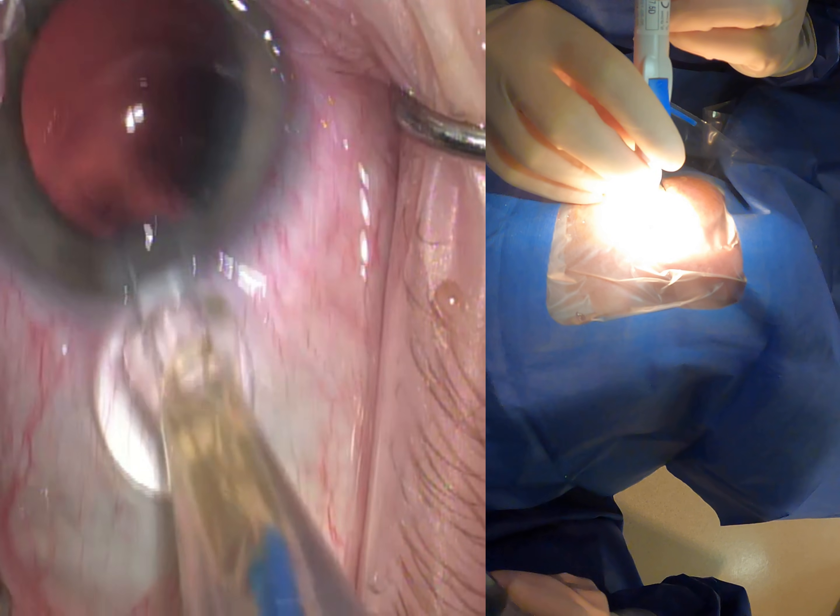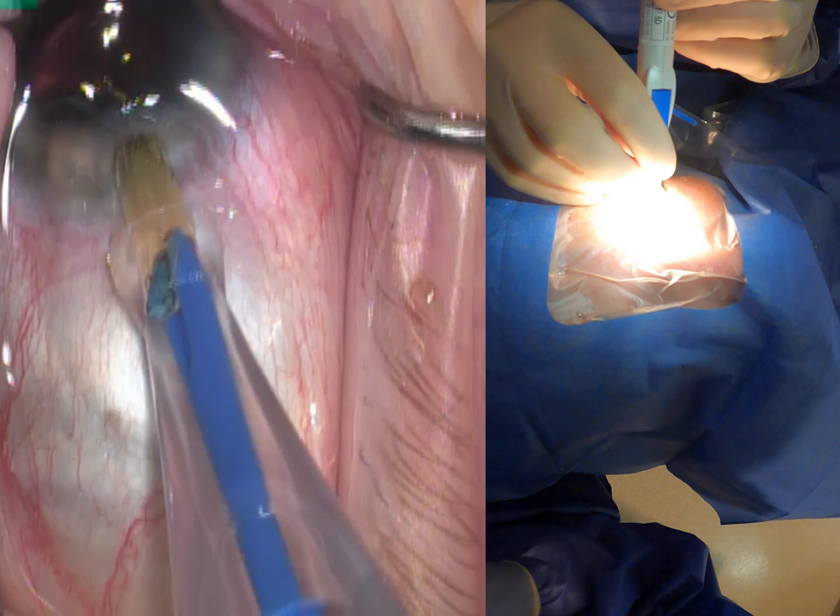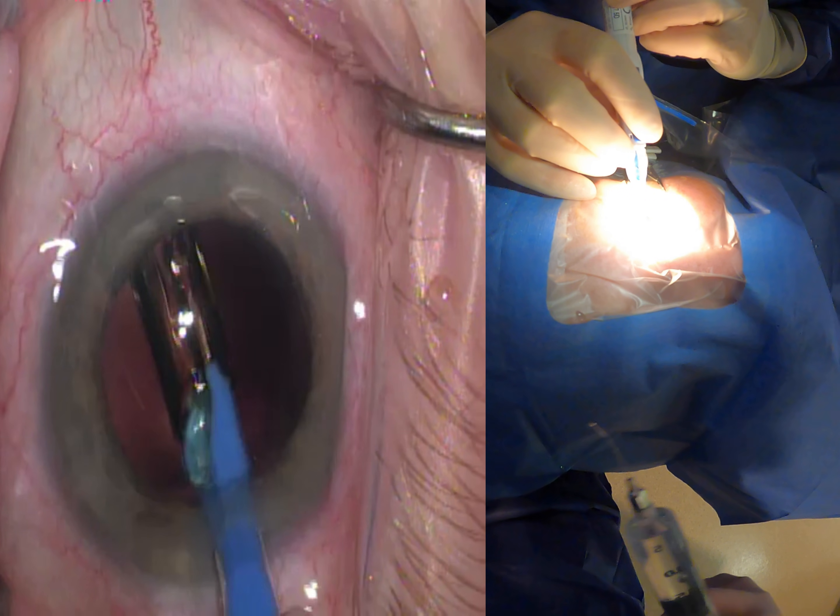This is the Clarion injector — light pressure on that wound, and then as it slips in I can just relax my hand and it'll do the rest for me.